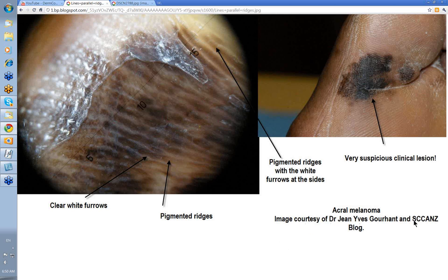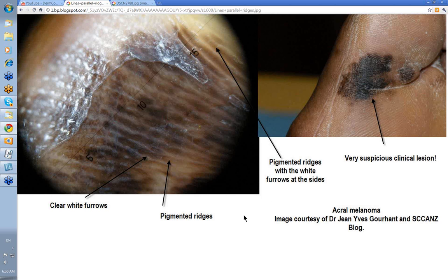This image is courtesy of Jean-Yves Gourhant from France and the SCCANZ blog. This lesion is obviously very suspicious clinically with very irregular edges and dark variation. When you put the dermatoscope on it, look at these thick dark ridges and the clear furrows in between — pigmented ridges with white furrows. This is the parallel ridge pattern of a very definite acral melanoma. Sometimes you'll see the little clear openings of the eccrine ducts, but they've probably been invaded by the melanoma.